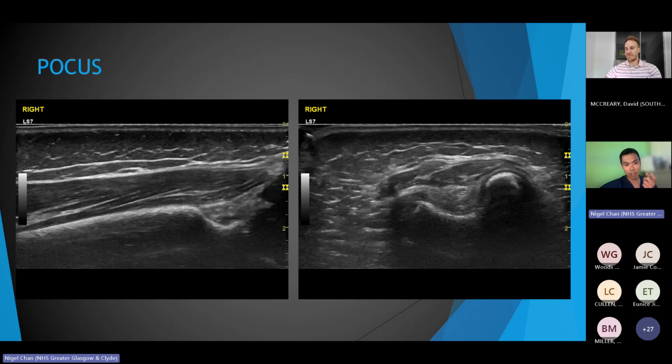The same kind of approach that I described: have a look for an effusion. So normal, abnormal, people in the room? Normal? Yeah, I agree, looks fine. Kids really don't have a lot of muscle bulk, so you get really good quality detail with the transducer. But yeah, that looked normal to me.